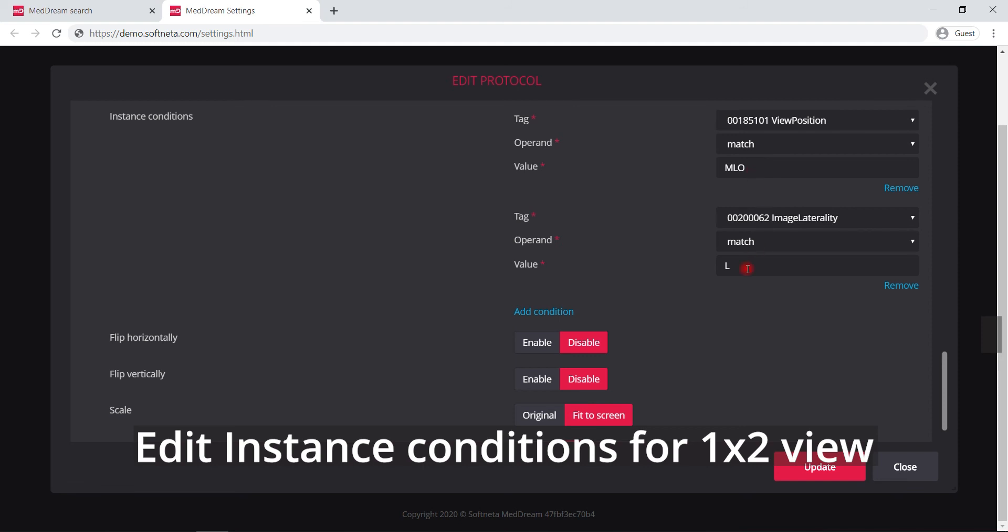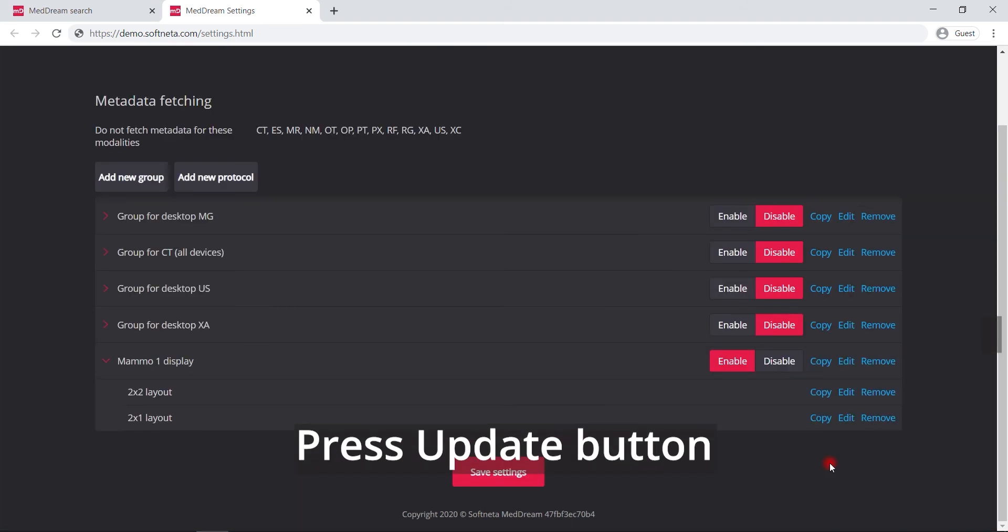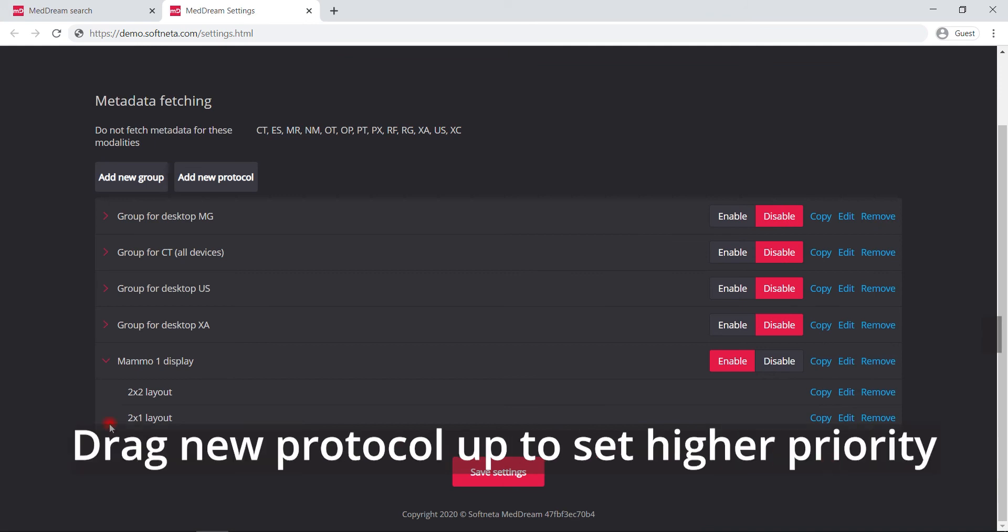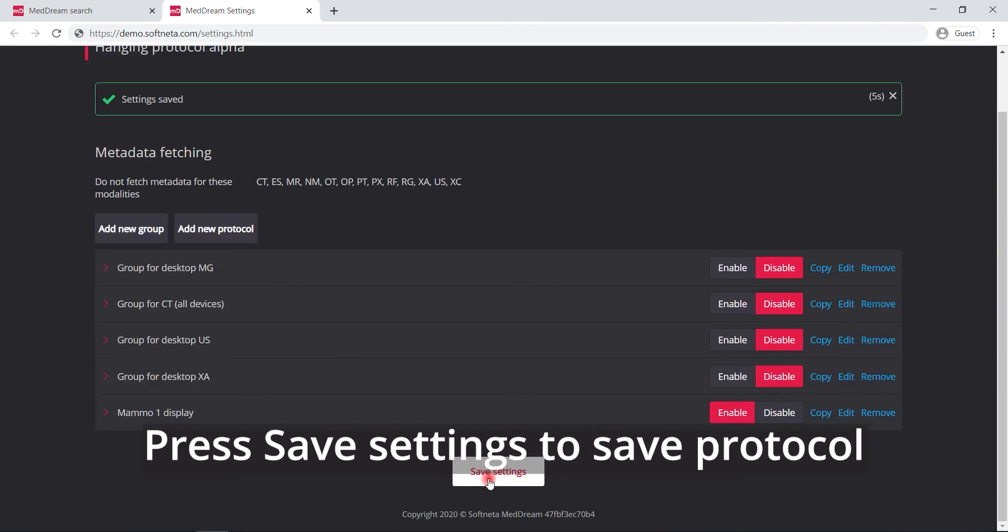To finish creating the protocol press update button. Drag new protocol up to set a higher priority. Press save settings to save protocol.